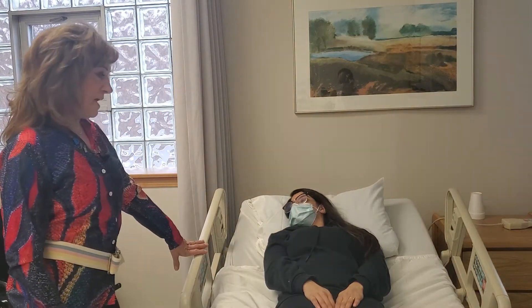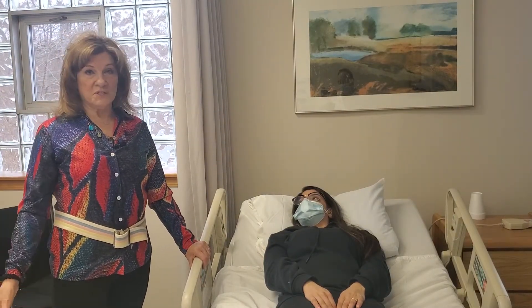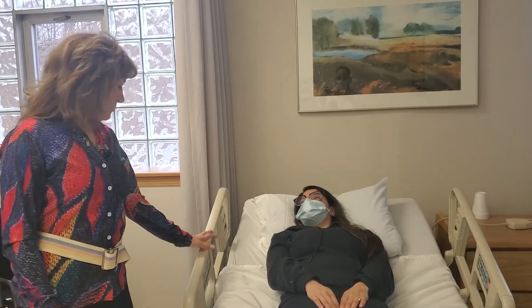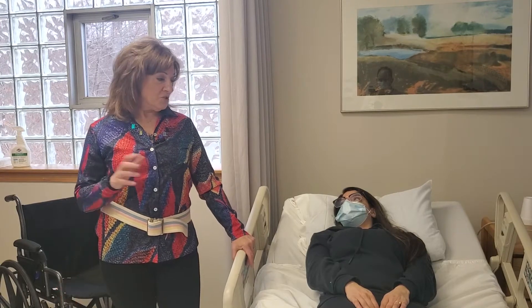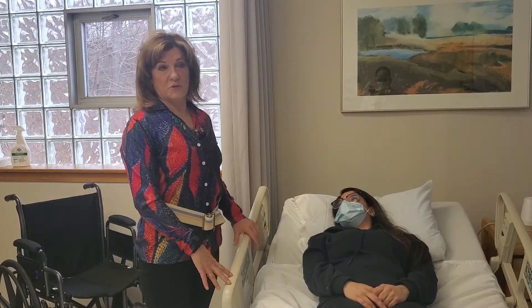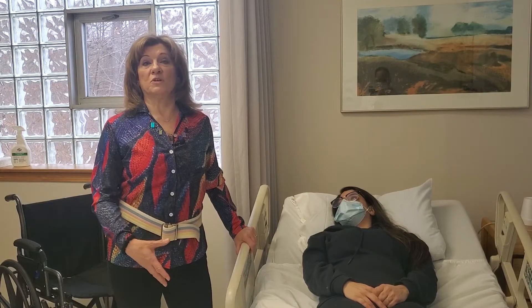Here we are in a standard hospital bed. If you're lucky enough to have one in the home for your person who's disabled, an older person, or yourself, having side rails is really great — it helps you leverage and move people. If you don't have one and you have a regular bed at home, there are ways of working with it. But if you're moving somebody into a wheelchair, you're better off with a hospital bed because the bed can go up and down, the head can go up and down, and you have railings. You would need a prescription for a hospital bed or an electric bed.